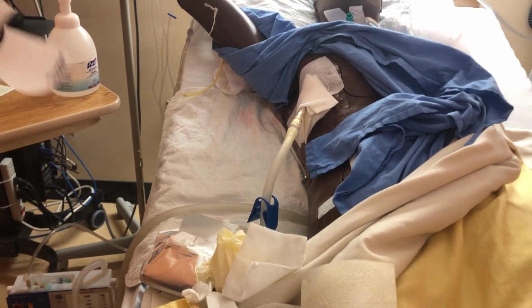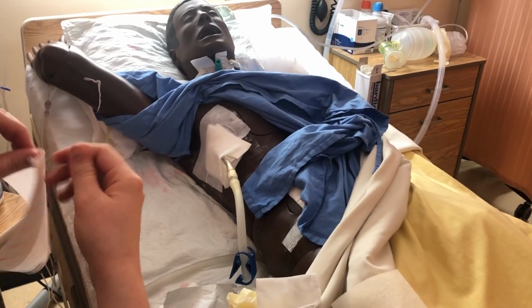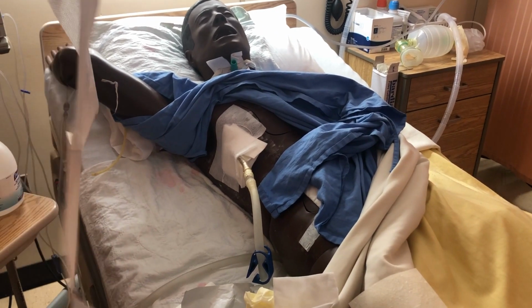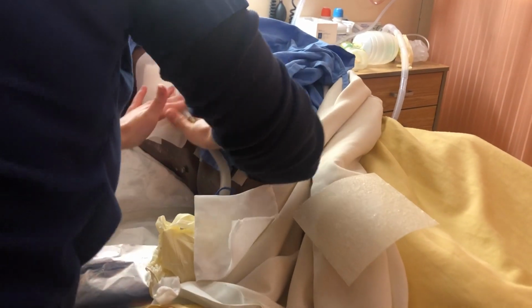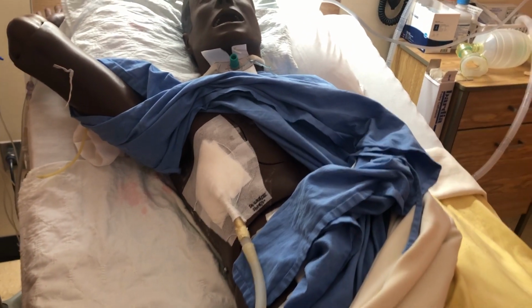And this one I've signed and dated. So I'm going to want to tent this piece around the chest tube so that if the chest tube gets tugged while my patient's moving around, it tugs on the dressing and not on the site itself. So we'll tent around that. And then I'm going to just make sure that I'm squishing the air out. Okay, so the chest tube dressing is done.